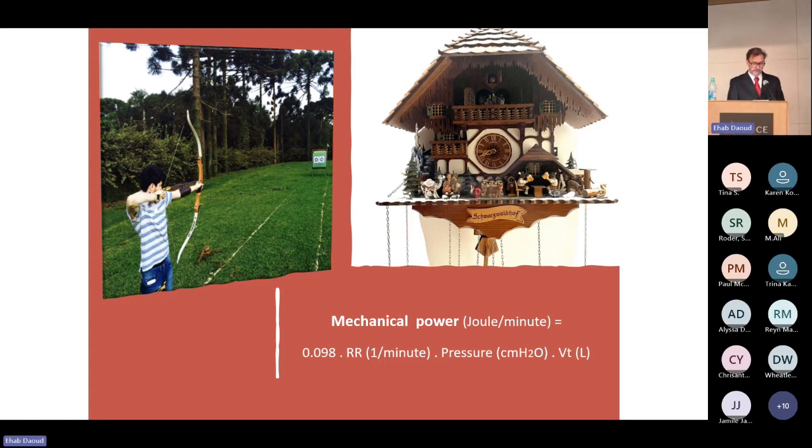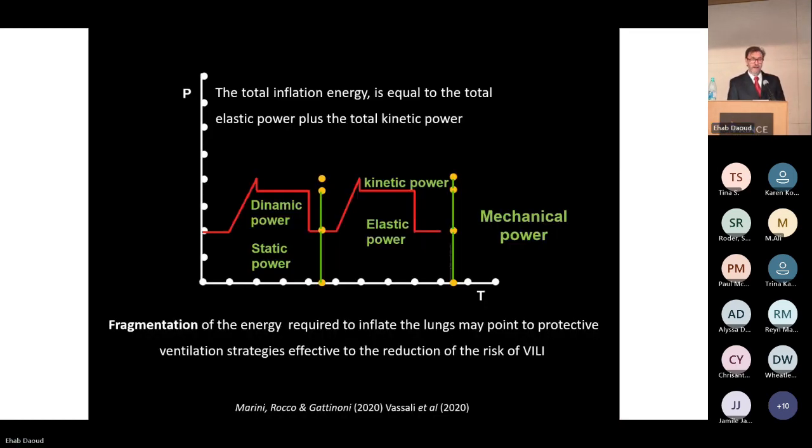But the inspiratory energy can be fragmented. Although the components of mechanical ventilation tend to be unified into mechanical power, perhaps the energy component needs to be fragmented.